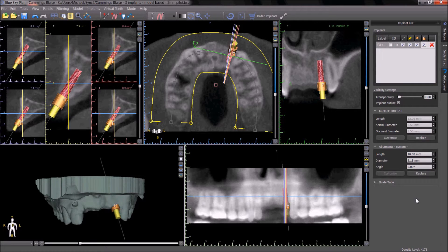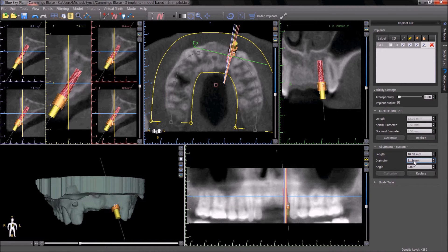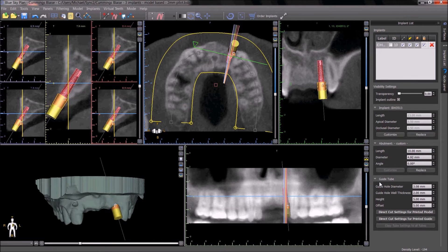Two modifications should be made in the implant list panel. The first modification is that the abutment diameter should be set to one-tenth of a millimeter less than the internal diameter of the metal cylinder. For example, if a metal cylinder with a 5.02mm inner diameter is going to be used, the abutment diameter should be set to 4.92. The second modification is in the guide tube section: the guide hole diameter should be set to one-tenth of a millimeter less than the diameter of the abutment.